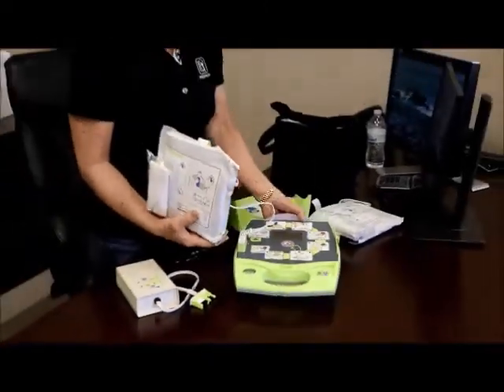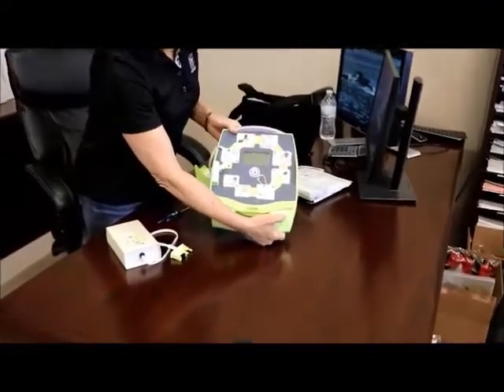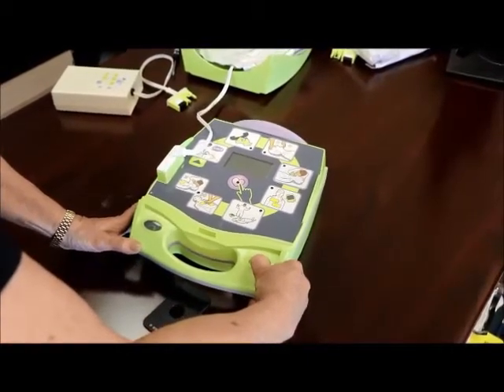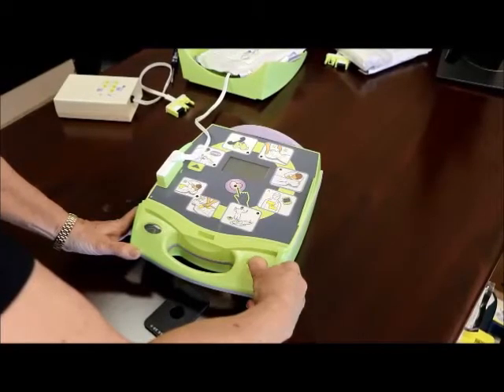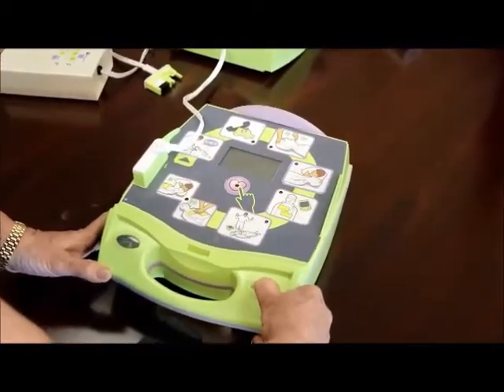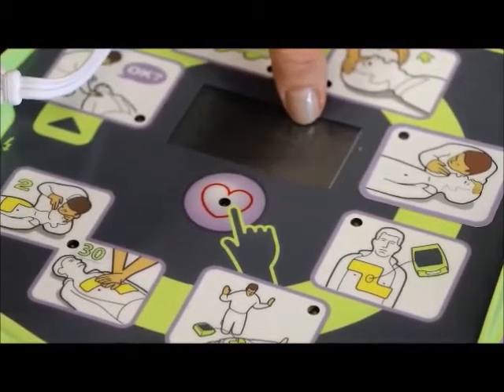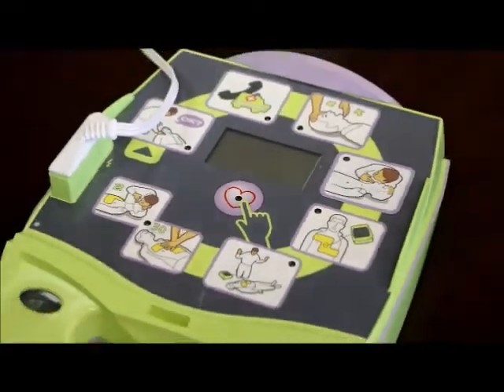The next thing we're going to do is find out what software version this is. To do that, hold the start button down for at least 7 seconds. You'll see it start to go through — the lights will circle around. Hold it down until it completes, then let go and it will do its self-test. You're going to look for the software version number. Anything less than 6.32 indicates that the software version needs to be updated.